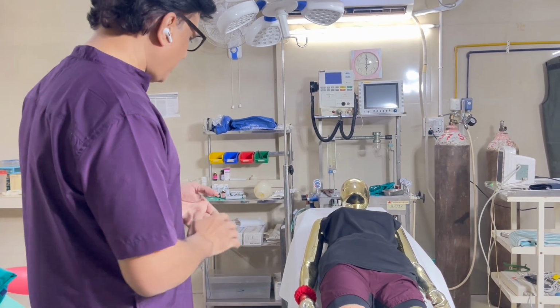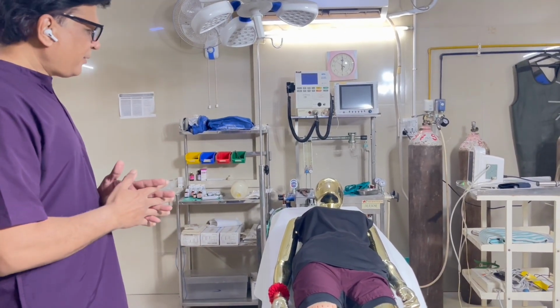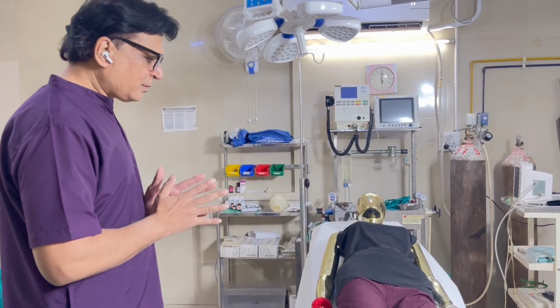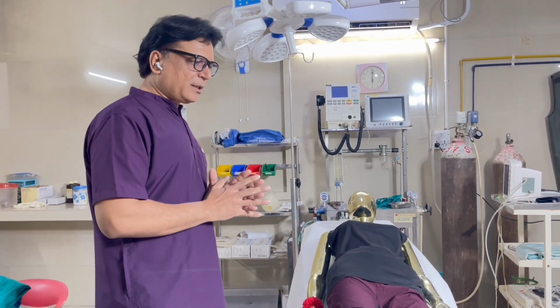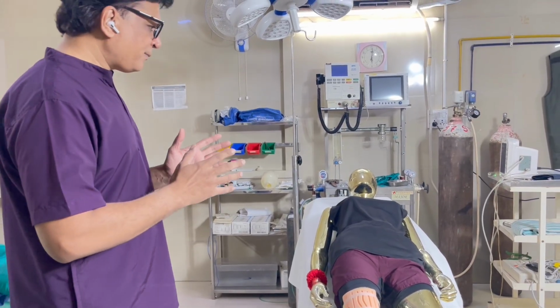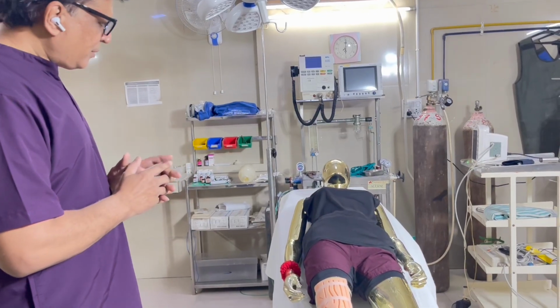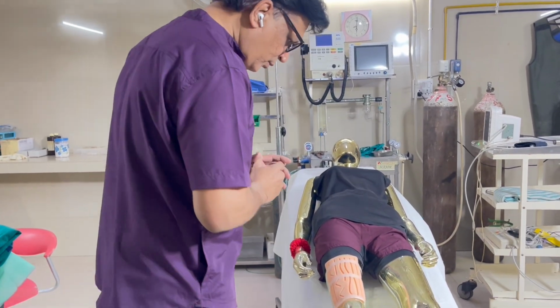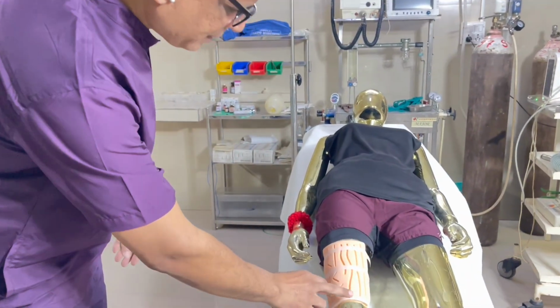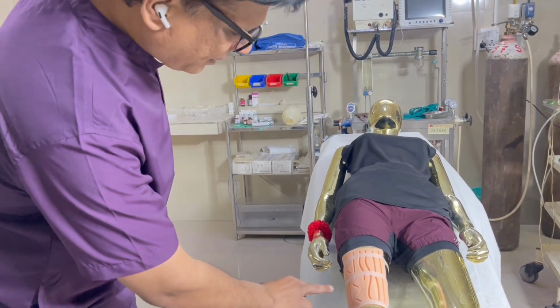So may I first check your wristband? So she's having a red wristband. Are you having allergy to any drugs, medicine, or any rubber or any cleaning material? No. Okay, have you had an injection of tetanus in the past? Okay. So Miss Linda, I will be just checking your wound. If it is dressed, I will remove the dressing and then check the wound.